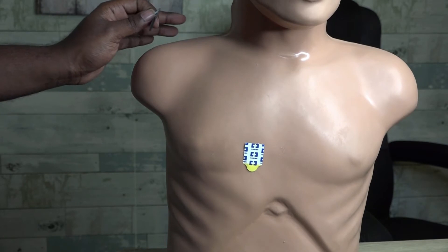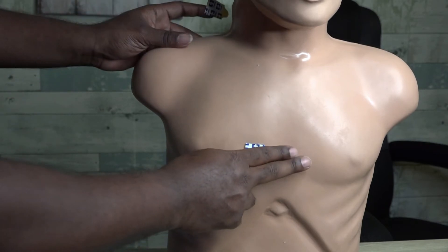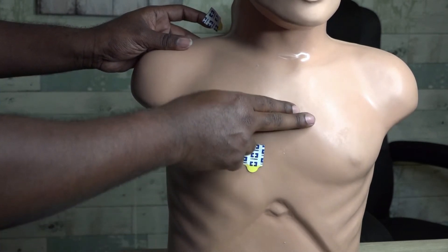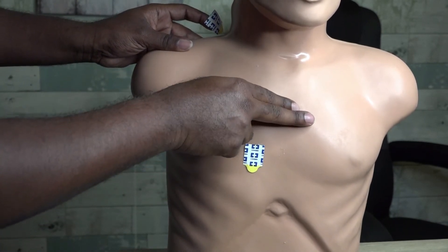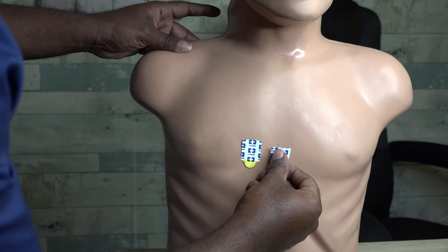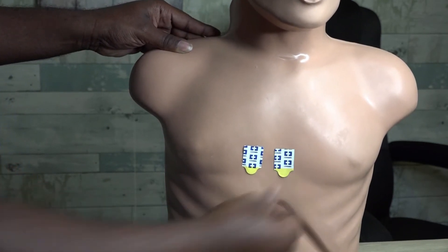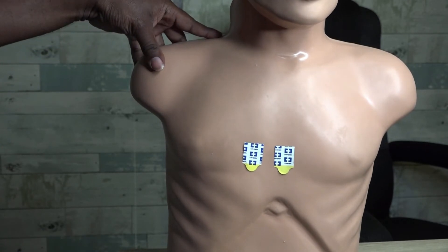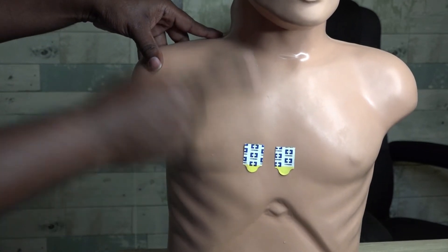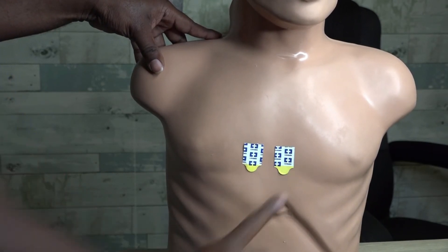For V2, we're going to be right next to where V1 is, but instead of being on the right margin of the sternum, V2 is on the left margin. Starting at the second intercostal space, we count: two, three, four — that is exactly where V2 goes. V1 is at the fourth intercostal space, right margin of the sternum; V2 is at the fourth intercostal space along the left margin of the sternum.